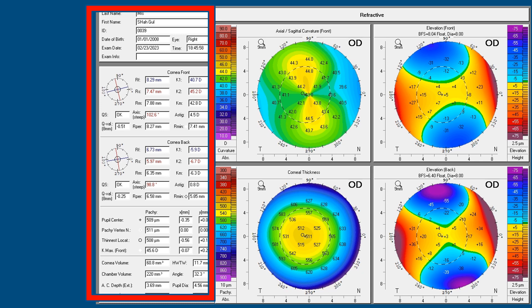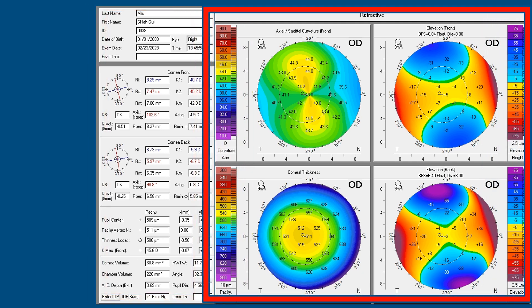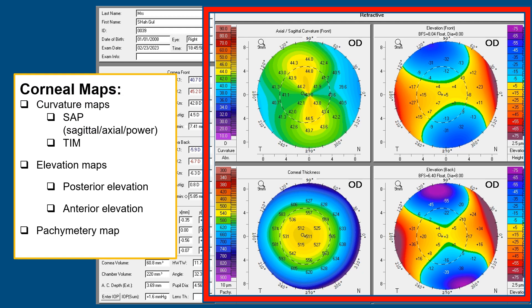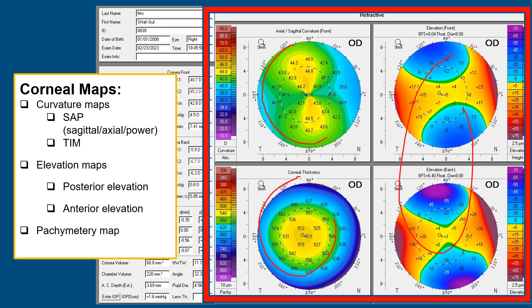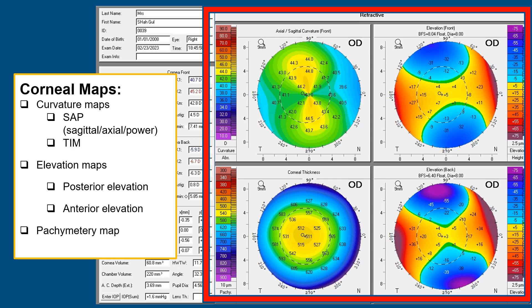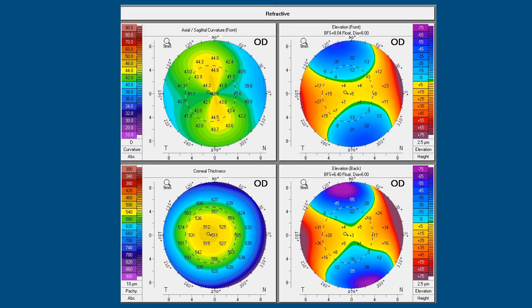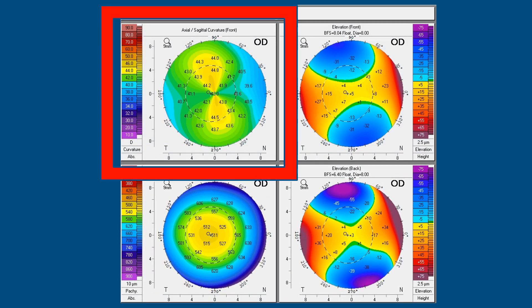We have done the left-hand parameters. Now we are going to shift to the right-hand parameters in the four maps. These maps are the curvature maps, elevation maps, and pachymetry maps as already discussed. We'll take them one by one, starting with the axial or sagittal map.